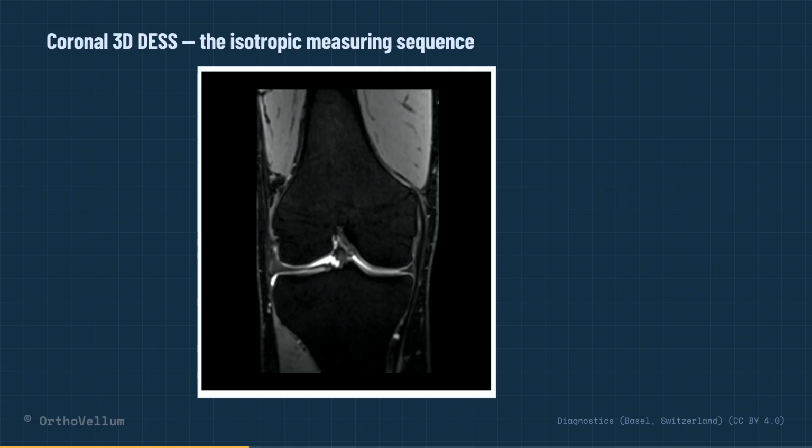This is the isotropic 0.5 to 1 mm world. Reformats in any plane, thickness maps on 3D joint models, repair monitored volumetrically. One caveat to carry: Disler's exact figures come from 1990s hardware, modern DESS, MERGE and 3 Tesla differ. The principle transfers, the numbers are not current performance.